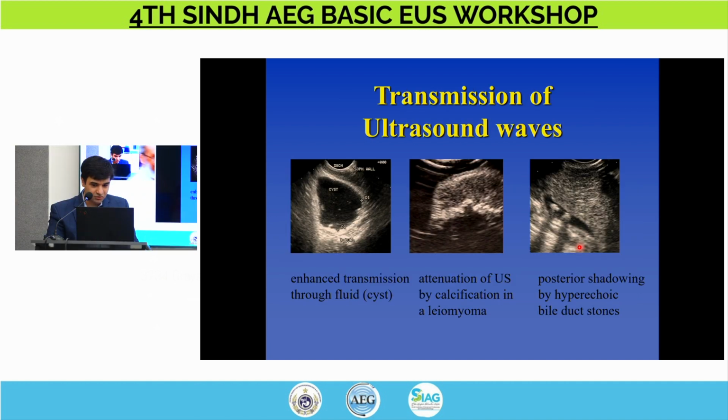So we spoke about transmission of ultrasound waves, and the other telltale sign that you would want to look for is the one we're looking at here. So what you see is a black structure beyond the transducer, and what we see below it is this white area that looks brighter than most of the tissue around it.